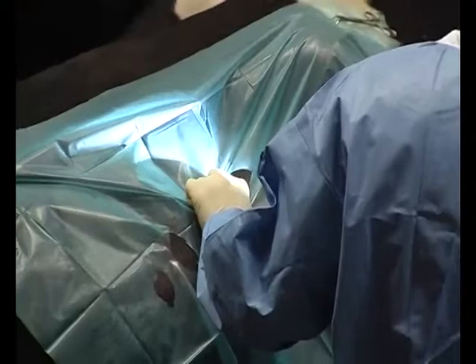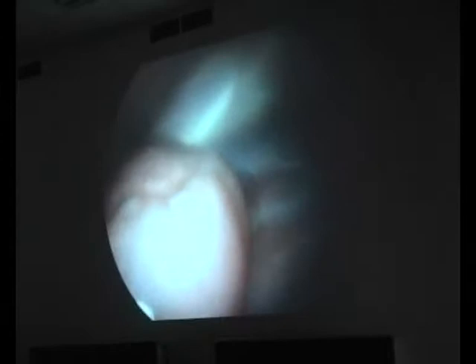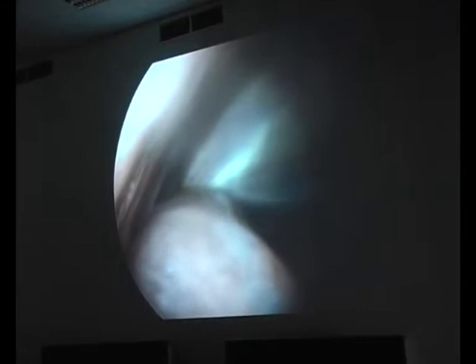Okay, this is what we want. You can see the displaced abomasum, also the spleen in front, the ribs on the left, and the top of the abomasum. Here is the omentum on the right side with a lot of fat in it. You see the movement, and here is the place of the puncture. You see?